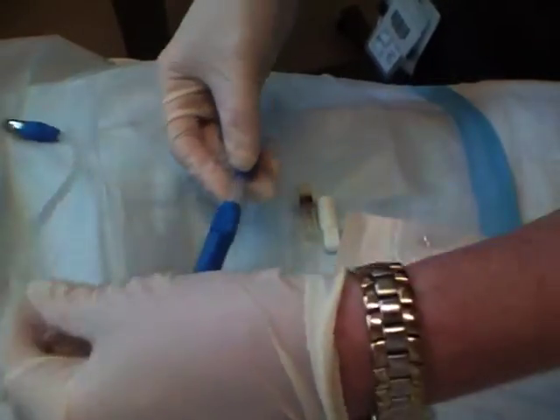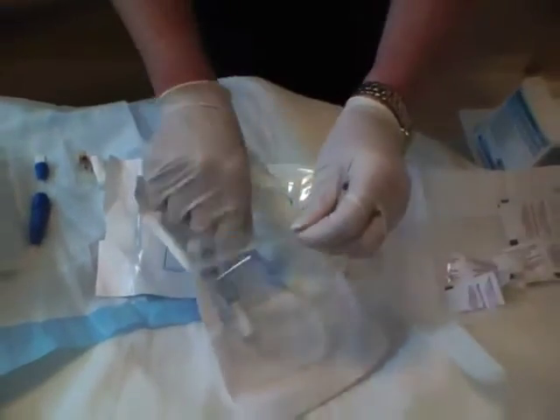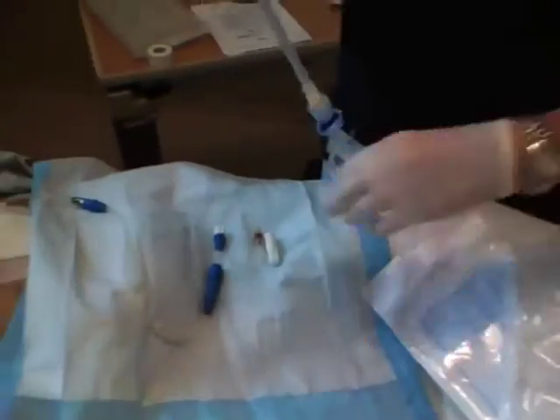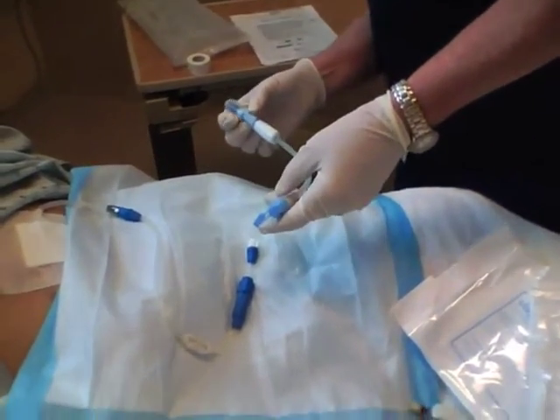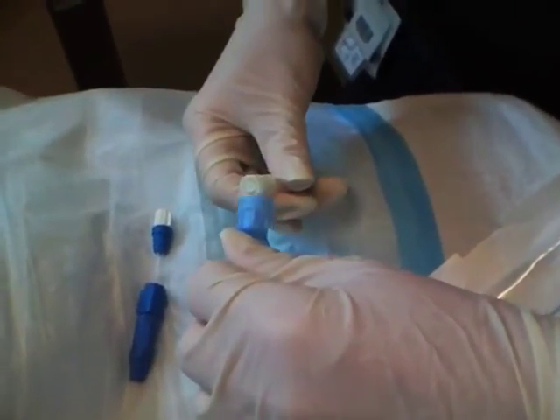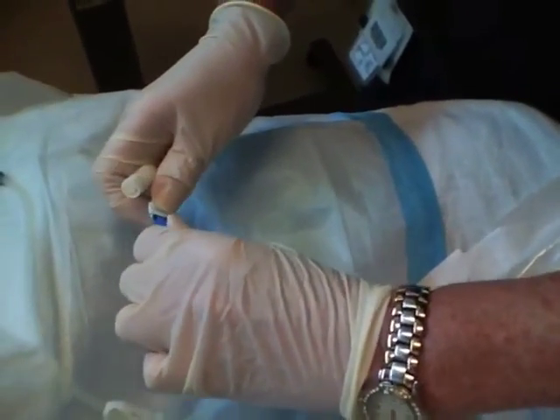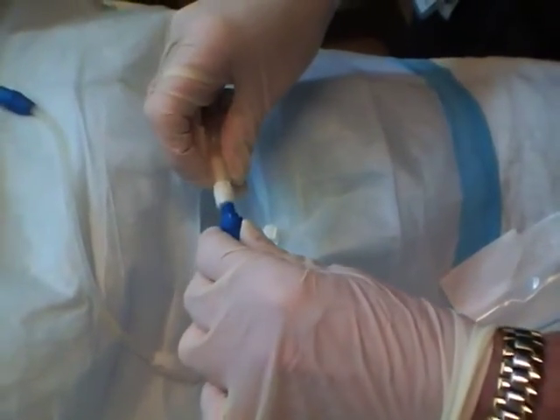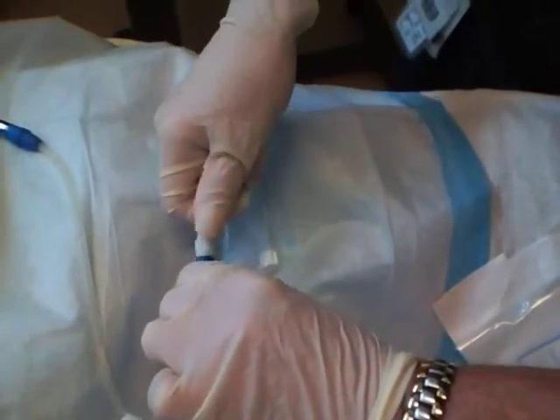Now this will be able to adapt to our Baxter mini cap extended life PD transfer set. These are disposable. The blue cap comes off exposing a female connection, and this is going to come off and expose a male connection. You always expose your male connection last, because it's the easiest one to contaminate.